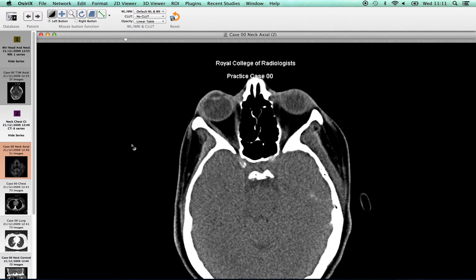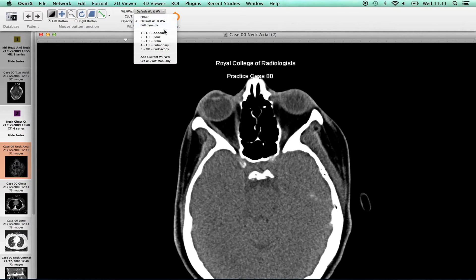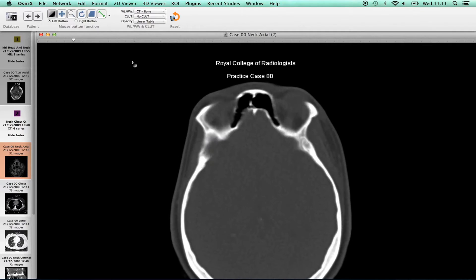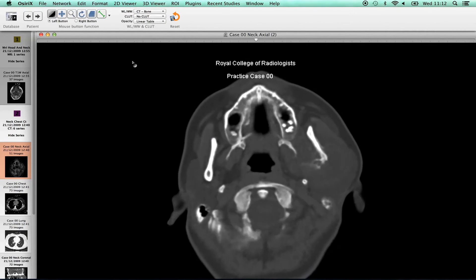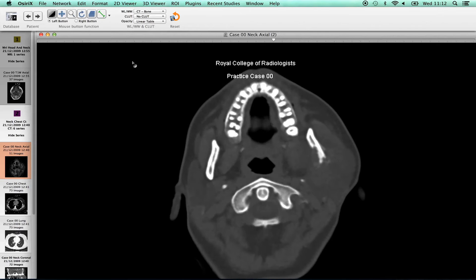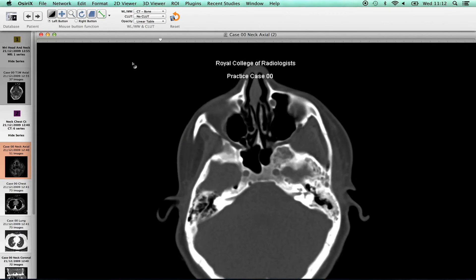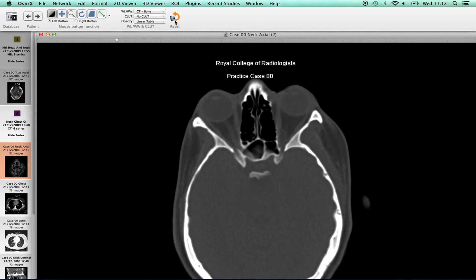CT window presets are also available. For example, bone windows, which can be selected by clicking on the drop-down menu here, which will provide a choice of abdomen, bone, brain or pulmonary windows. Select an appropriate window setting before scrolling through. To go back to the original soft tissue window setting, just click the reset button.